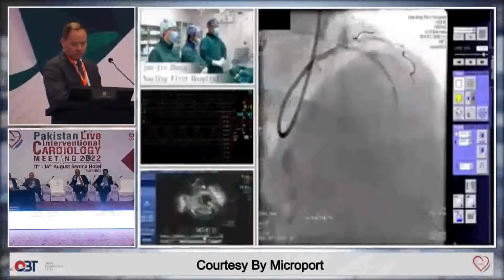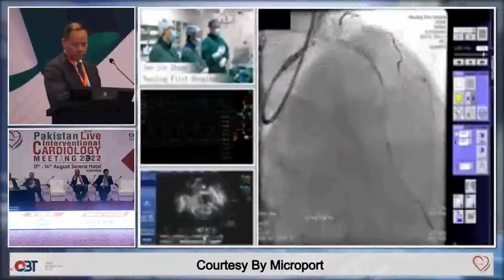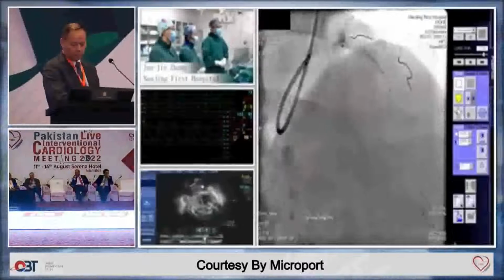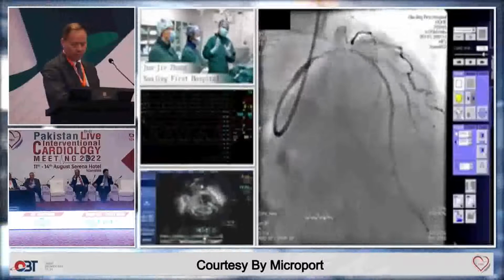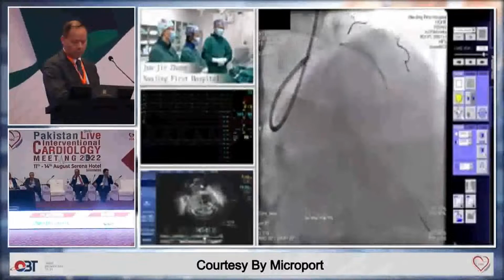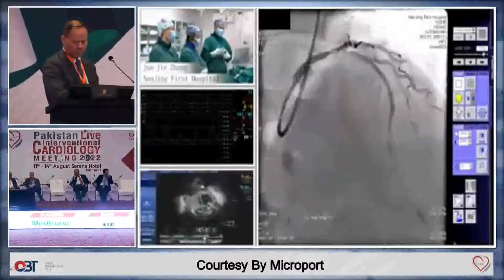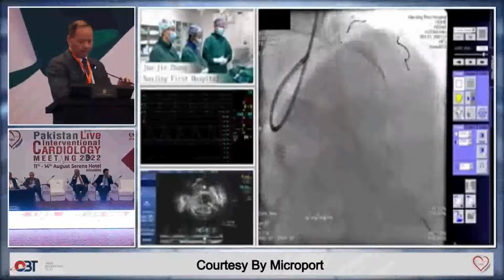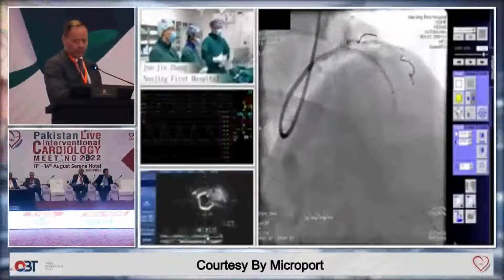Yeah, actually, considering IVL shockwave is also a very good option for this kind of calcification. Considering the EF is low, and also considering from the IVUS imaging, the calcium arc is less than 270, so we think using the NC balloon predilation can do a good preparation for these calcified lesions. So we didn't want to do the shockwave for this case, considering it's a low EF.